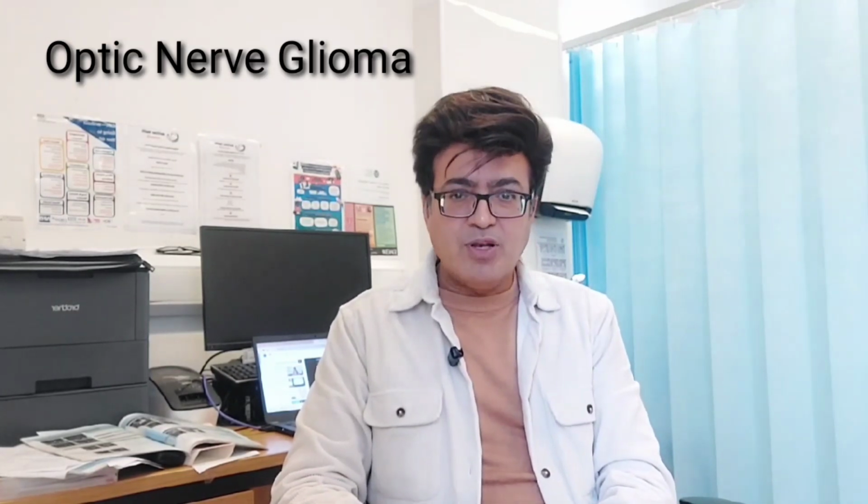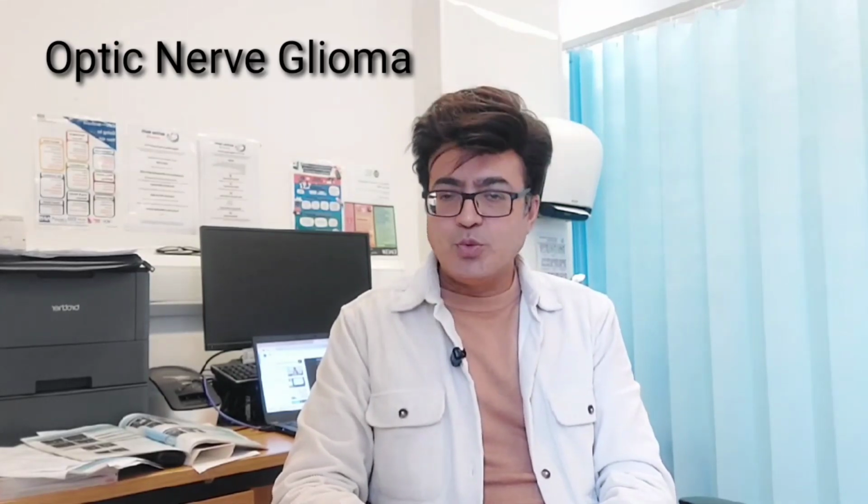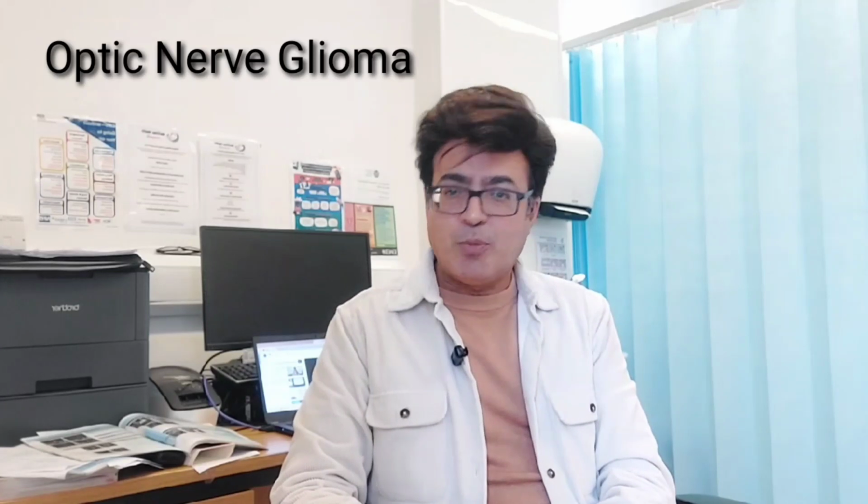As far as the clinical course is concerned, it happens to be very indolent, and MR is the best modality for that. On T1 weighted images, it will appear as iso-intense or hypo-intense, while on T2 weighted images it will appear as hyper-intense. So how will we appreciate all this on the MR images? Let's start looking at the optic nerve glioma, or in other words you may call it a pilocytic astrocytoma.